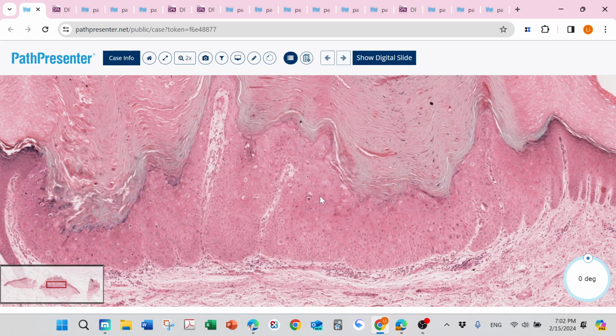And the other one is kind of rare, that is Merkel cell. We can see the atypical cells go to the epidermis. Also sebaceous carcinoma has in situ components and can also have this pagetoid cell. And if in the breast, we also need to know mammary Paget's disease, which also has this pagetoid spread.